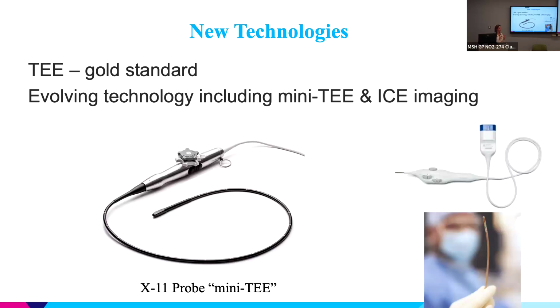So this is the mini TEE. We don't call it the PEDS probe, okay? The PEDS probe is a different probe. It does not have any 3D functionality. The X11 is the new mini TEE probe, and it only will work on the new machine upgrade. The software upgrades 11.0 or 11.1 are the only ones compatible with this new probe. So if you have a patient that is unable to pass an adult-sized X8, then you can use this one, but make sure that you have the new updated machine.